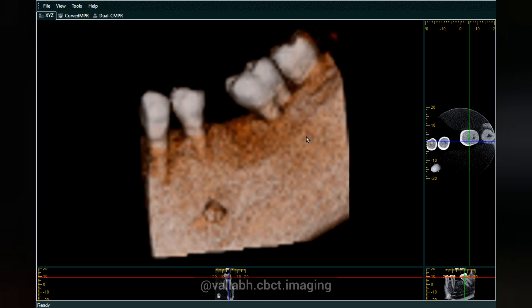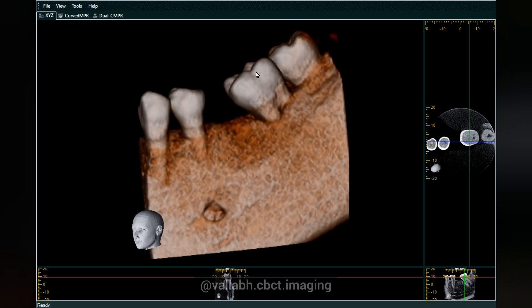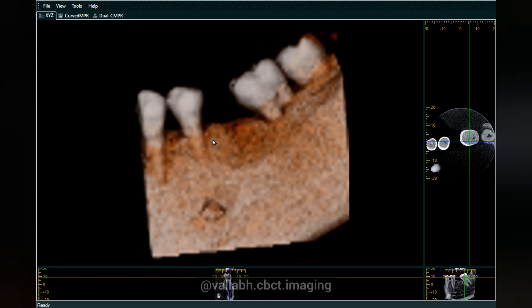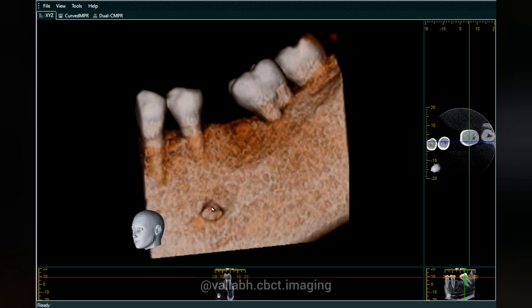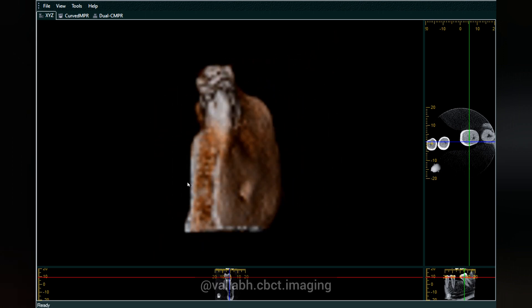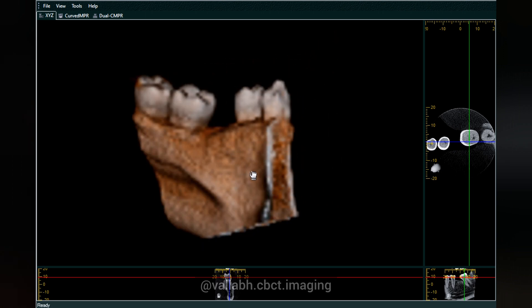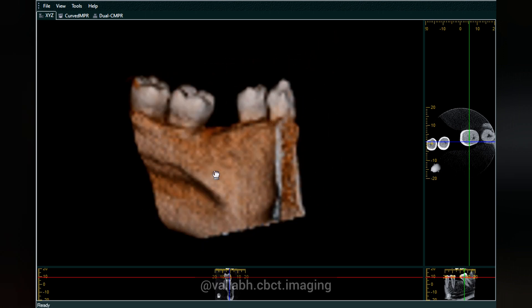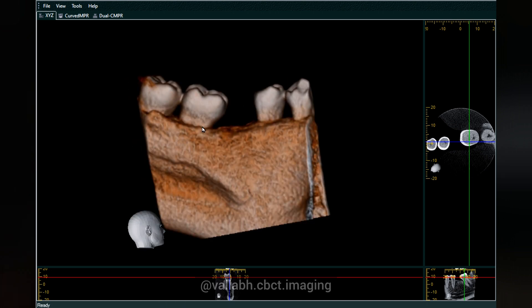This is a tooth, this is the alveolar crestal bone, and this is the mental foramen on the buccal aspect. Coming to the lingual aspect, this is the lingual cusp of the teeth, this is the lingual undercut area, and here is the mylohyoid ridge.